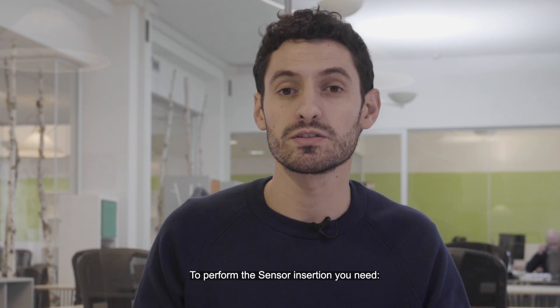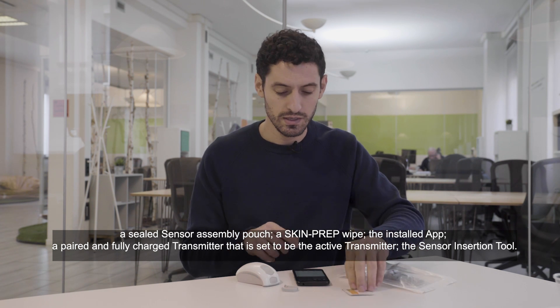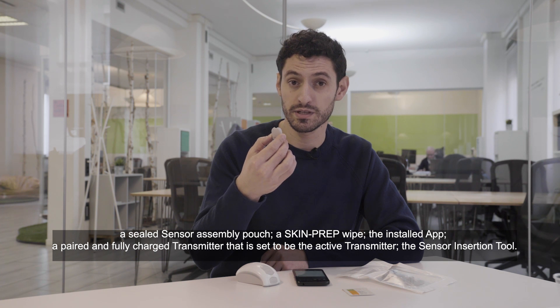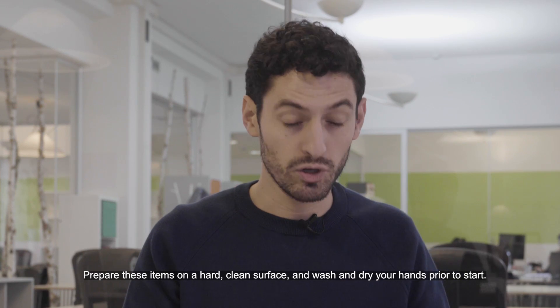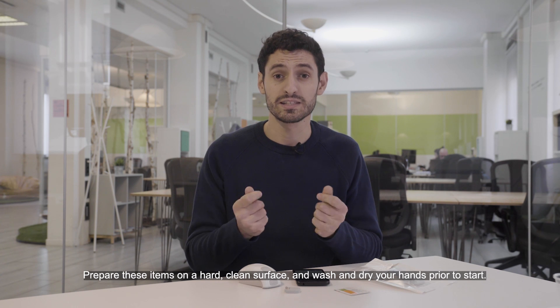To perform the sensor insertion you need: a sealed sensor assembly patch, a skin prep wipe, the installed app, a paired and fully charged transmitter that is set to be the active transmitter, and the sensor insertion tool. Prepare these items on a clean, hard surface and wash and dry your hands prior to starting.